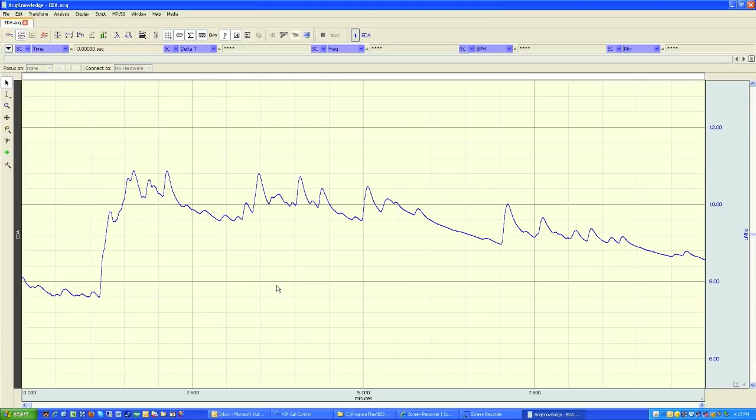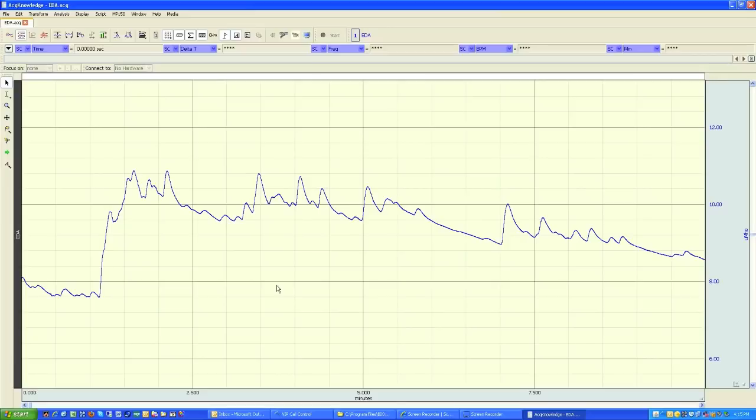It can be a handy way of presenting your data at a meeting or showing colleagues the exact way in which the data looks while it was recorded. But also it will allow you to add additional calculation channels after the data was recorded and view them in pseudo-real-time.